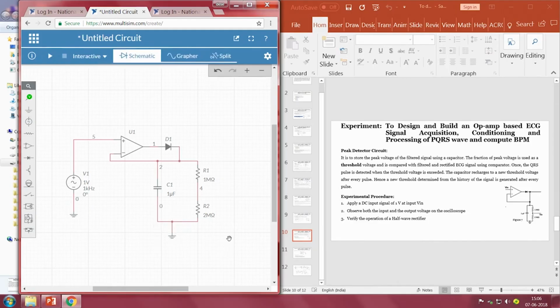What we have to measure in this circuit is the output voltage, whether the capacitor output follows when I change the input voltage. In order to understand, let me remove this particular terminal so that there is no connection here. So, we can easily see whether it is following the peak or not. Then we will make this connection, and at this particular junction or node, we connect another voltage output, a probe, and we will see how the output signal looks like, right.